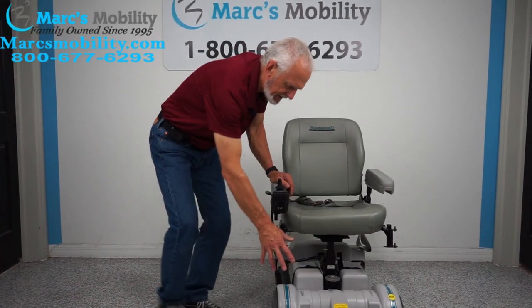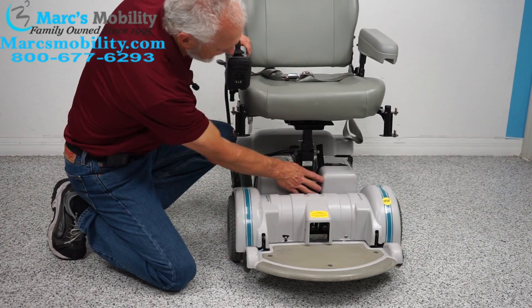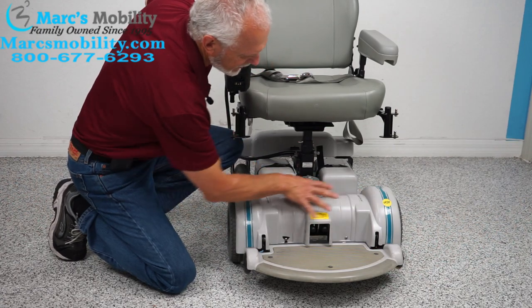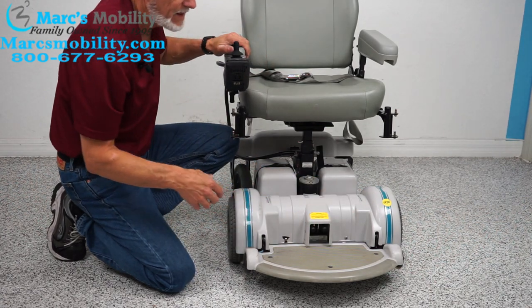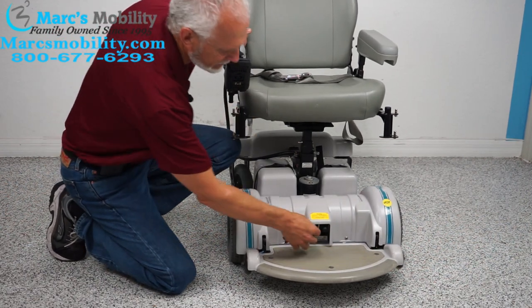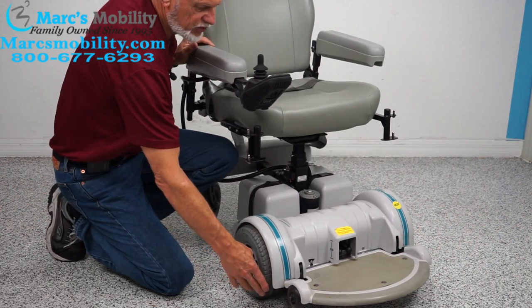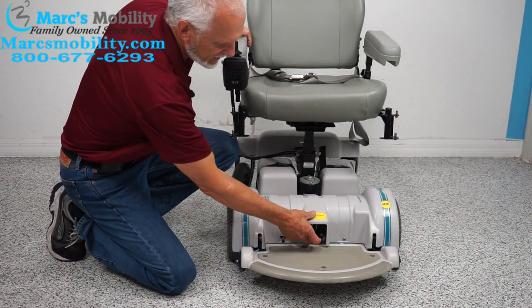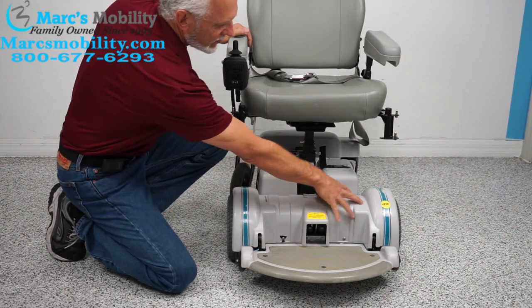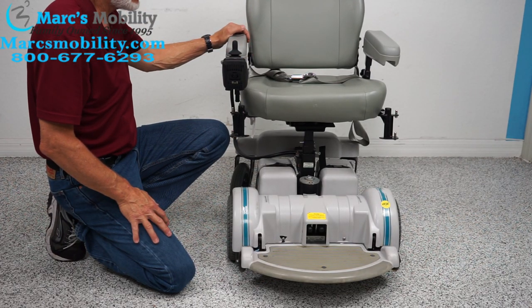You have your rounded foot plate, which Hoveraround is famous for. You can see the motor right here for the seat lift. There are two levers — there's a motor here and a motor on this side. This is where you put the chair in neutral. If you had to roll the chair, you'd turn the power off, but even with the power off you can't roll it. If you push the two levers down, now you're in neutral on both sides. When you're done rolling it, put the two levers back up — now you're back in gear. Turn your power back on and you're ready to go.